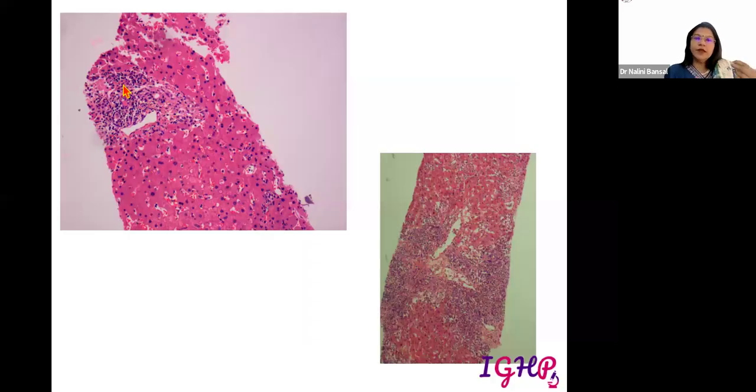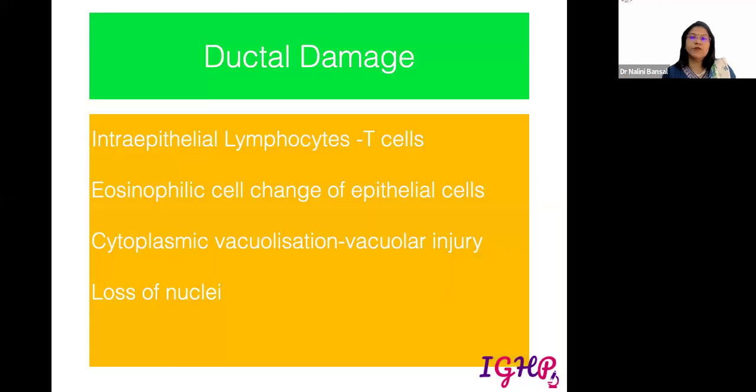Now, the infiltrate can go from mild to moderate. There is more clustering and aggregation of the lymphocytes and mixed cells. So here we have more than a mild degree of infiltrate, which is moderate in nature. At times the infiltrate could be very severe and sometimes it can also spill over into the liver parenchyma. So we could have different grades of inflammatory infiltrate. As we move from mild and moderate to severe, the amount of mixed infiltrate would be the same, though in the severe infiltrate the lymphocytes are proportionately more compared to the other cells being seen there. So that was the first component, the portal inflammatory infiltrate.